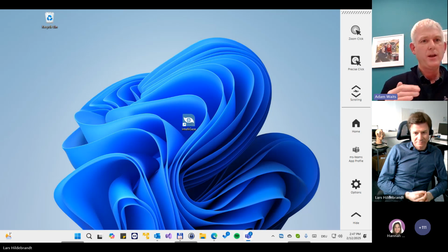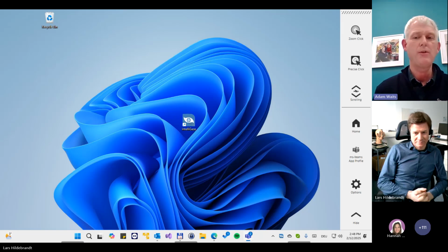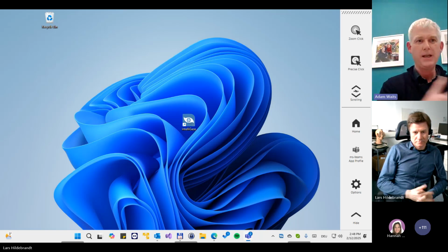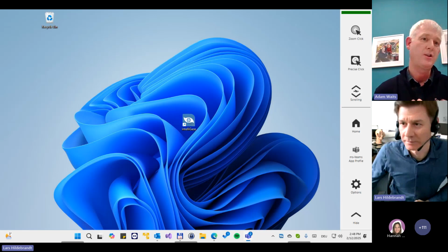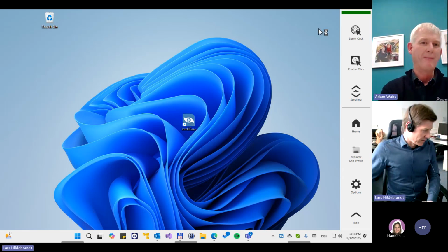And I think in the UK, we see a lot of people using Grid with IntelliGaze and Grid with Vida and older Alea cameras. So maybe just going over the understanding of when we are prioritizing, or how it switches between Grid and IntelliGaze for different calibrations. Because there's an option in Grid as well for who prioritizes that. There is an option in Grid.